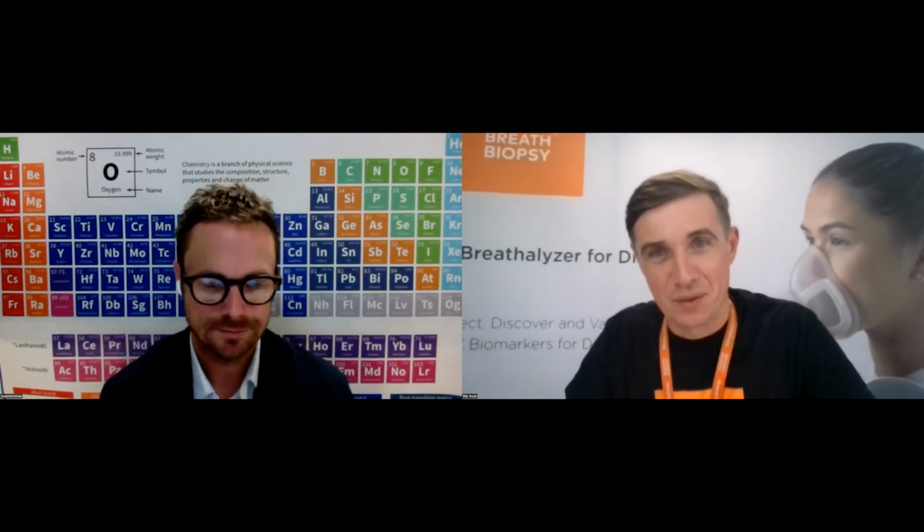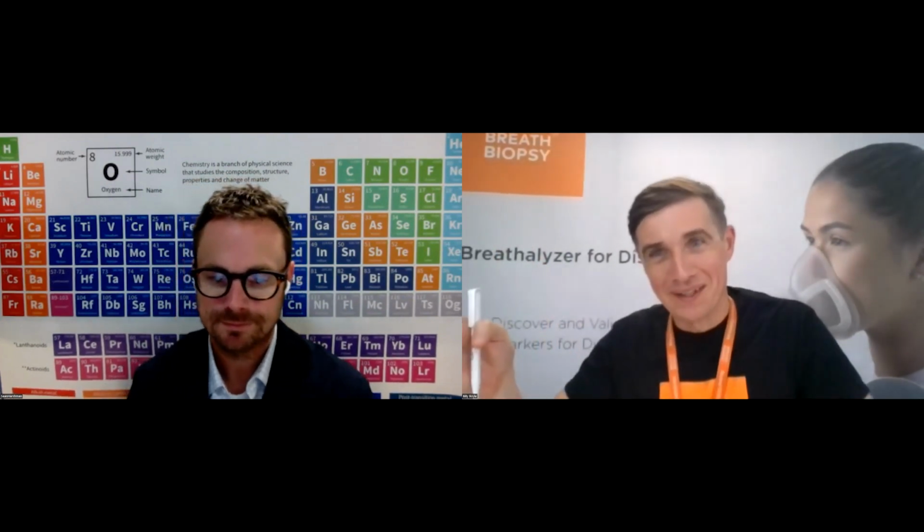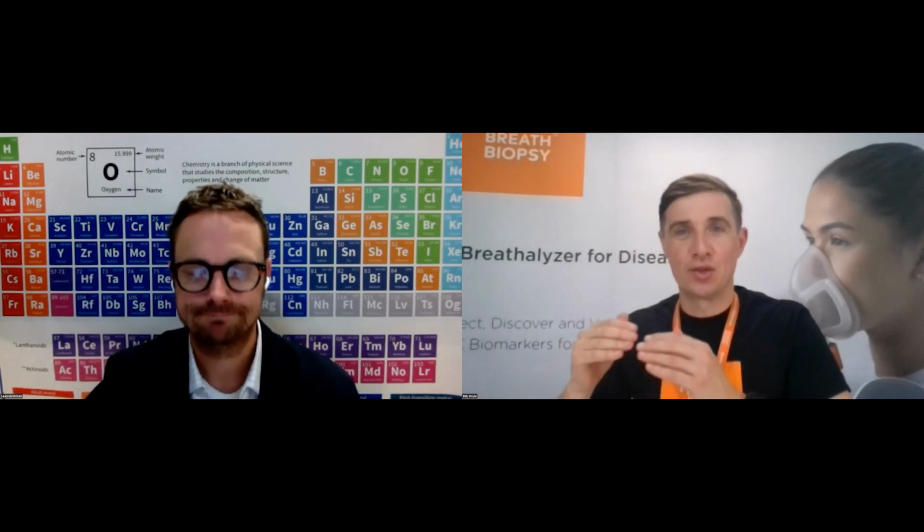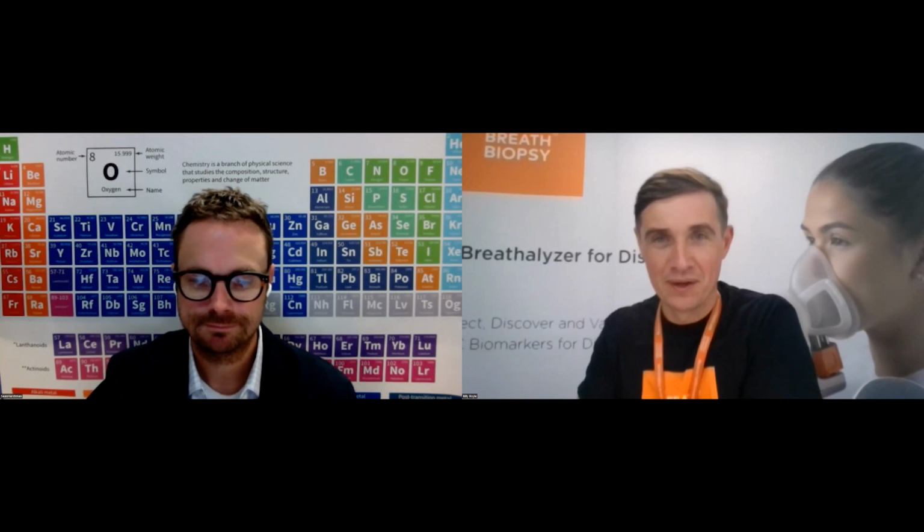I was going to kick us off. I thought the data showing the levels of VOCs in background relative to VOCs that are on breath, and then showing that often those things that are definitively in the background often appear in the literature, is something I totally see as a big issue. And when you talk about the standardization, I presume you're not talking about any one particular piece of hardware. It's more about the standard practices and SOPs to ensure you're getting a genuine on-breath compound. So I was wondering if you could provide the audience any thoughts you have on what those types of reporting standards should look like.